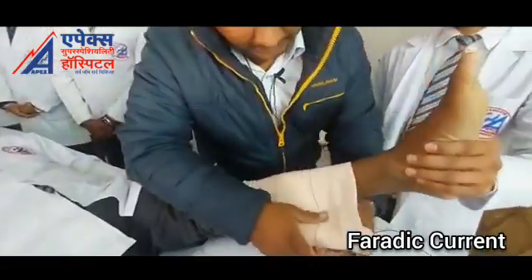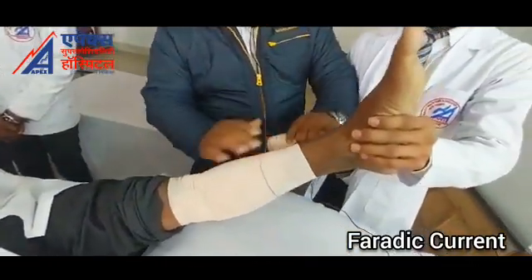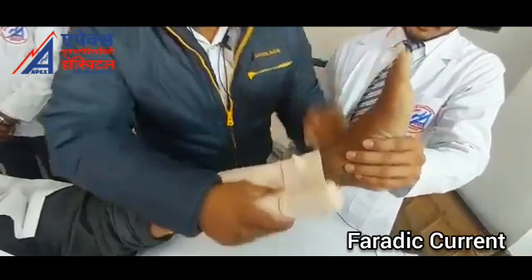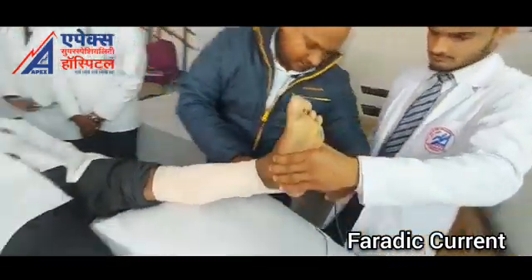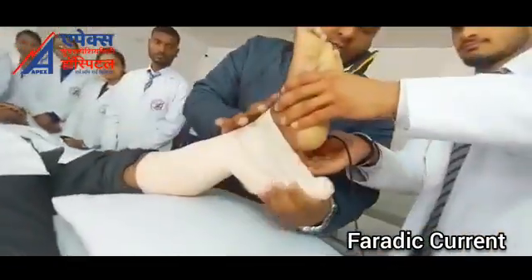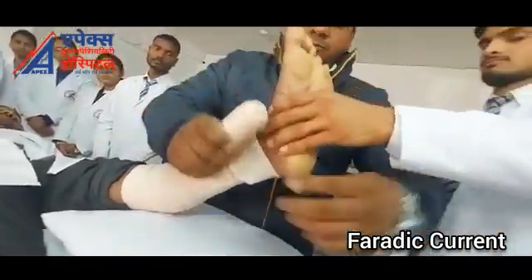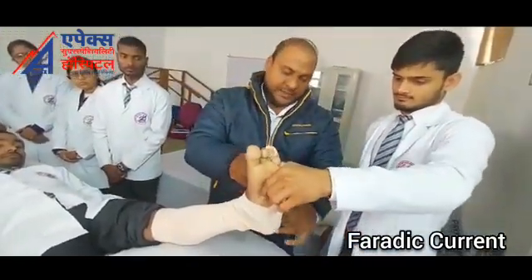When you are rolling down the crepe bandage, you must remember that another line just crosses over this line. After rolling this, you must all take precaution while rolling the crepe bandage on the patient's foot and the patient's entire limb.